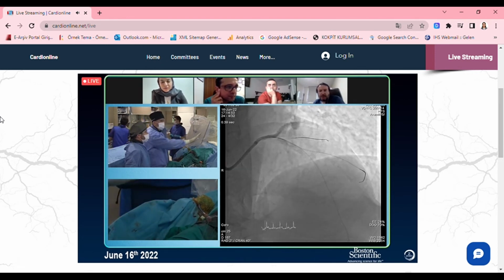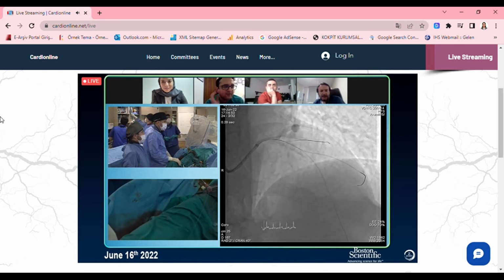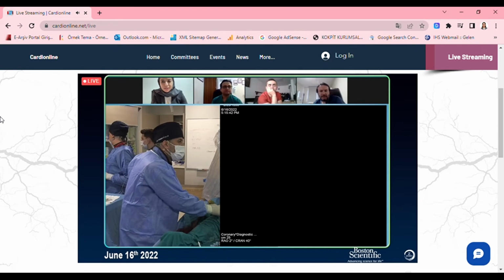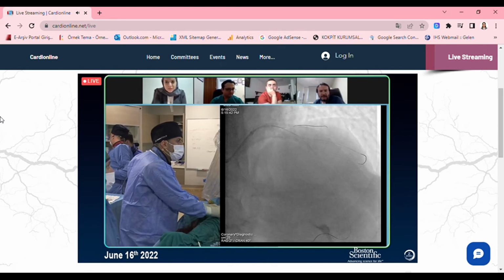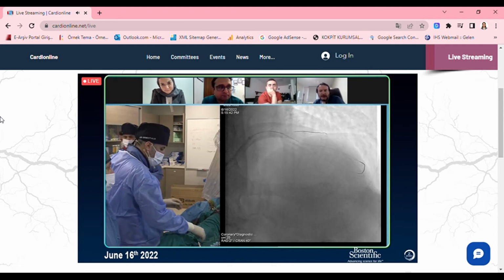I am craving for seeing the IVUS now. 2.5 NC for the diagonal. What are you going to do? 3.75 NC. You can do a nano crush for that diagonal, 3.75 NC, just with a balloon in the lady. The man also likes nano crush.